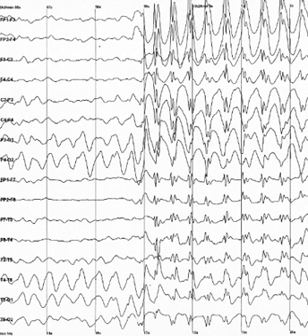Waveforms are subdivided into bandwidths known as alpha, beta, theta, and delta to signify the majority of the EEG used in clinical practice. The practice of using only whole numbers in the definitions comes from practical considerations in the days when only whole cycles could be counted on paper records. This leads to gaps in the definitions, as seen elsewhere on this page.